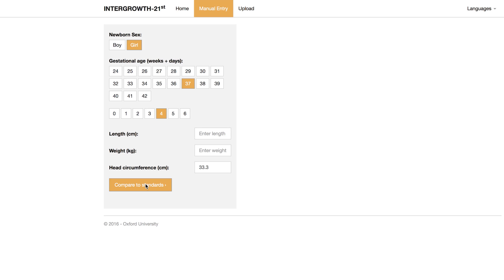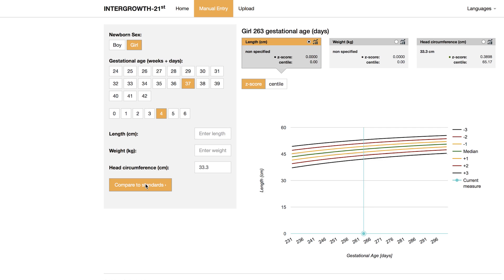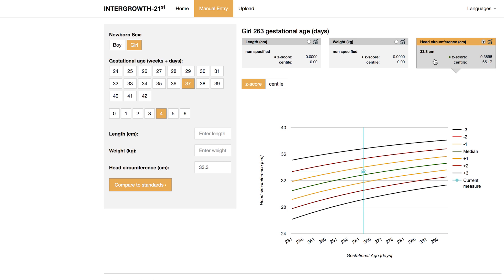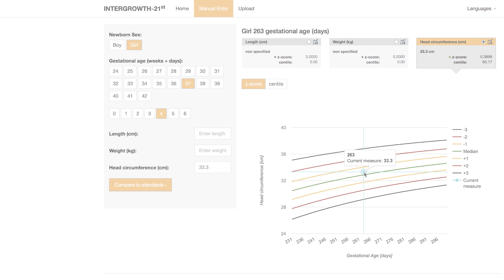Then click Compare to Standards. The app calculates the Z-score in centiles and provides a graphical display of the results. Select the measurement of interest — here, head circumference — and see the position on the charts.